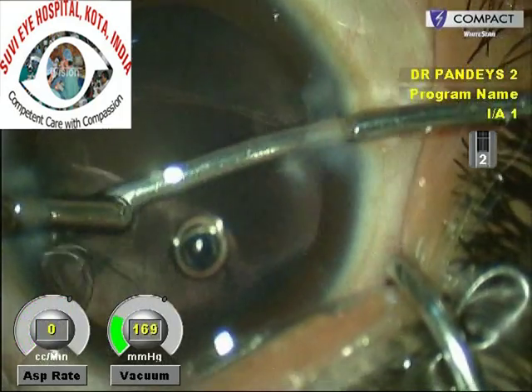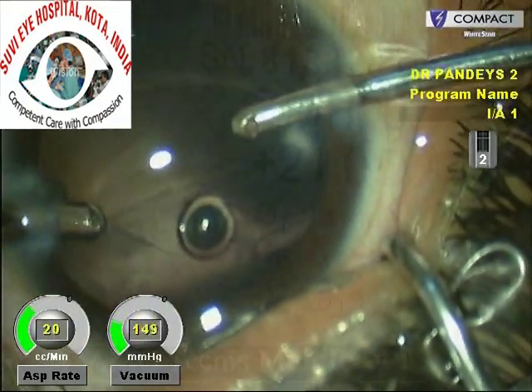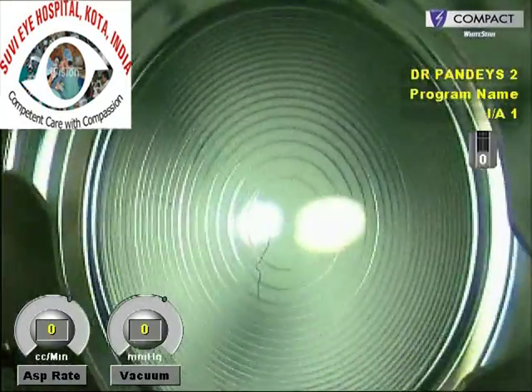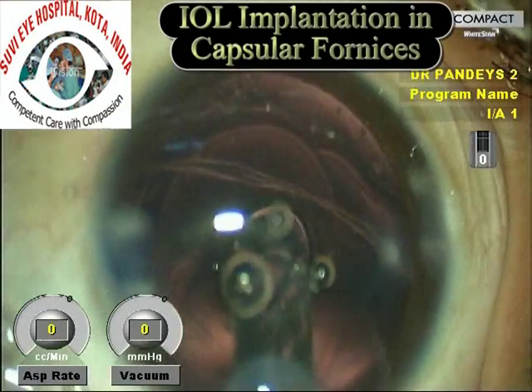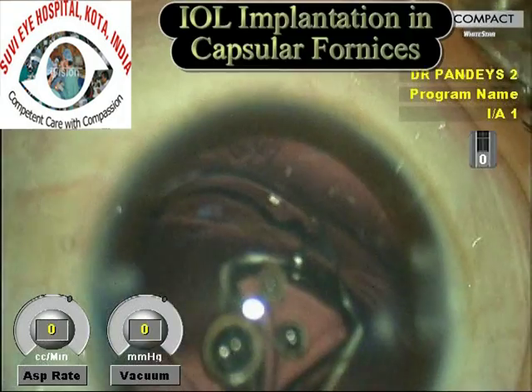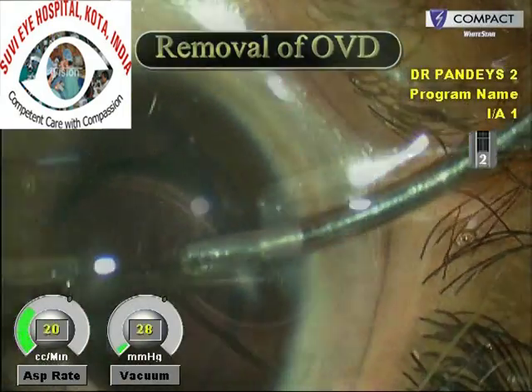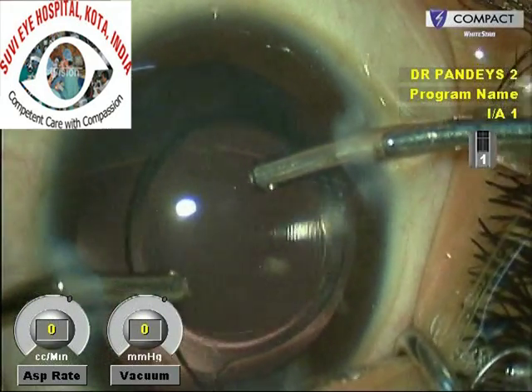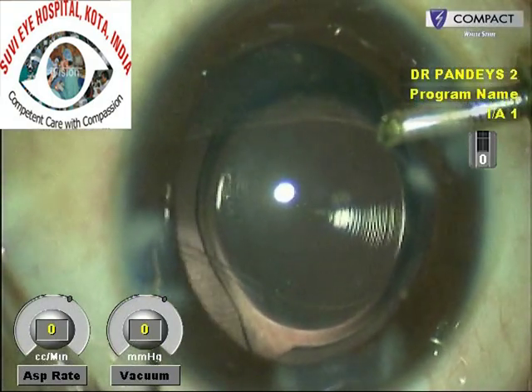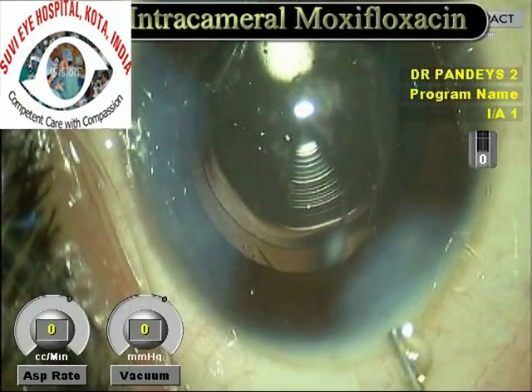Here you can see the split in the anterior capsule very well. While it is not standard teaching to implant multifocal IOLs in the presence of capsule injuries, because this was a child with a unilateral cataract, we leaned in favor of implanting a multifocal IOL — we felt it would be fairly stable and reasonably well centered, and we wanted to avoid spectacle dependence. The IOL was implanted with the haptics in the intact capsular fornices superiorly and inferiorly, was stable within the capsular bag, and remained well centered after viscoelastic removal.